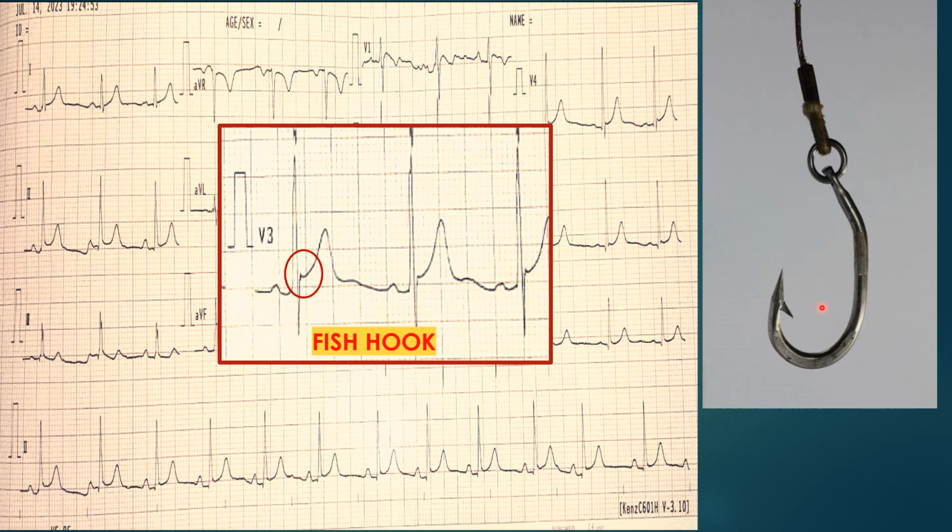As a reference, those who go fishing use this hook to catch fish. If we look at the shape of this, it resembles a shape like this as well. So it looks like a hook, and this is called a fish hook appearance.